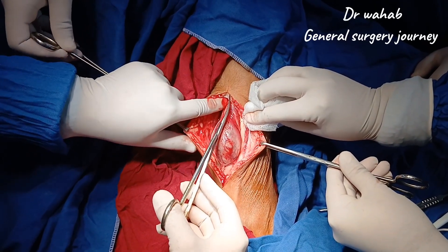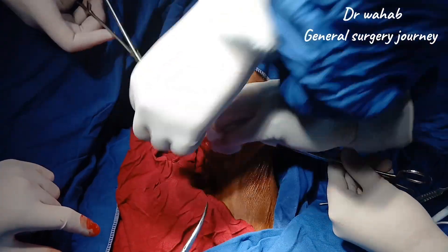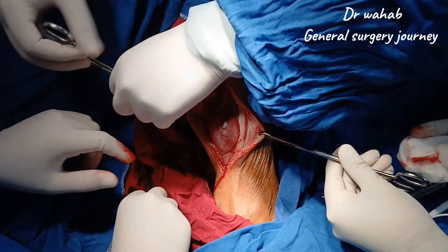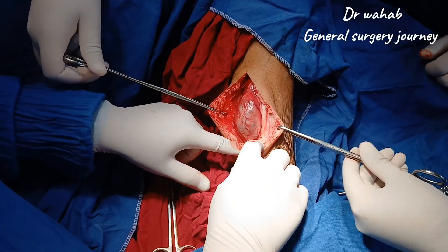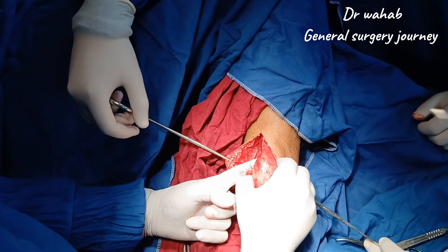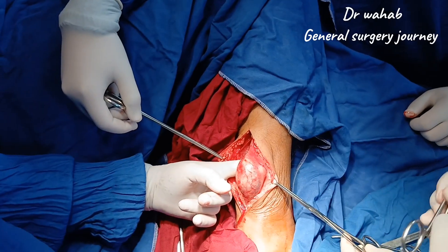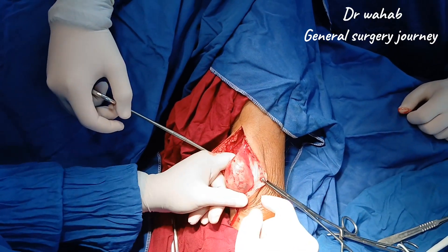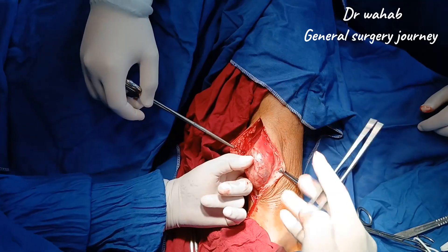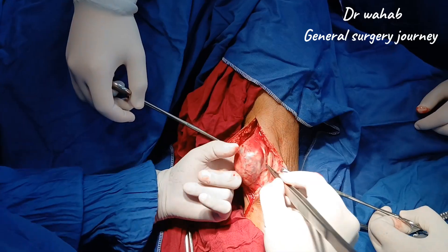Using a combination of sharp and blunt dissection, we begin to free the mass from the surrounding soft tissues. We proceed gradually along the capsule, maintaining gentle traction to keep the field clear. Small feeding vessels encountered are cauterized to ensure hemostasis. Special care is taken to protect adjacent muscle, fascia, and neurovascular structures.